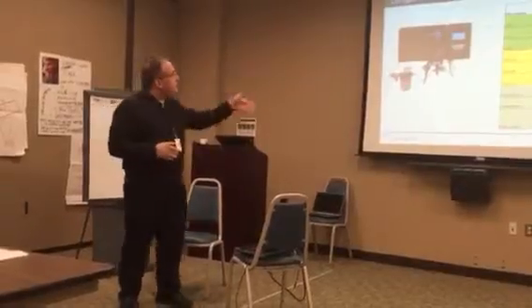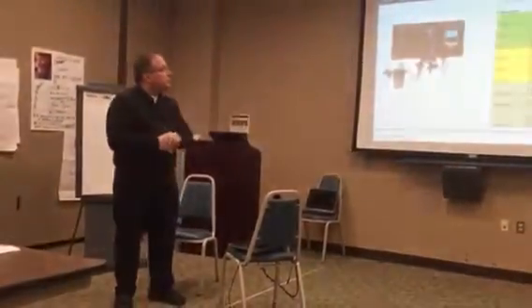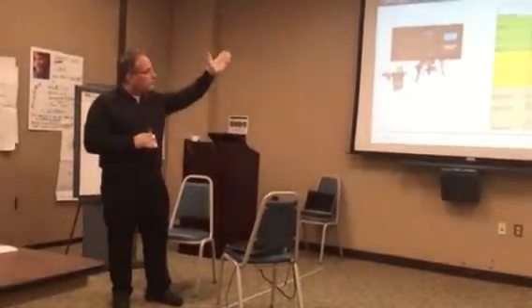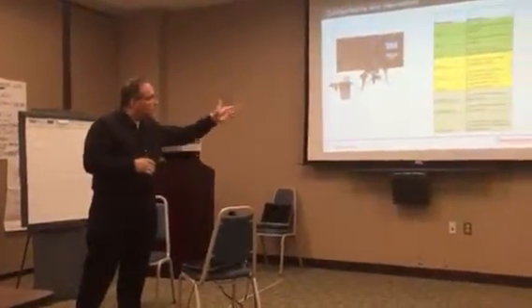Then something to remember when you order configurations and descriptions. Top 3 are without pH, without the pH measurement. The bottom 3 in the yellow. So the green is without, the yellow is with the pH measurements, and then on the bottom you have your different reagent configurations.